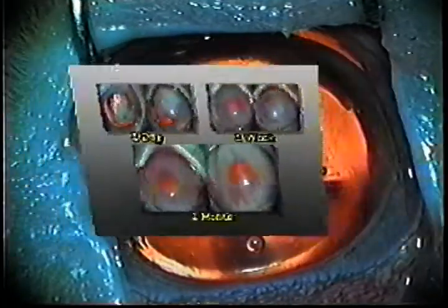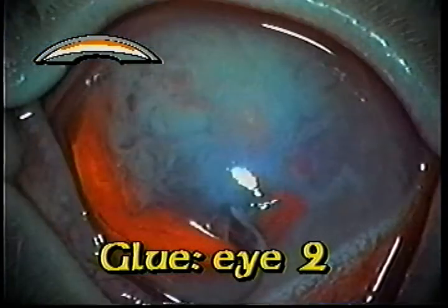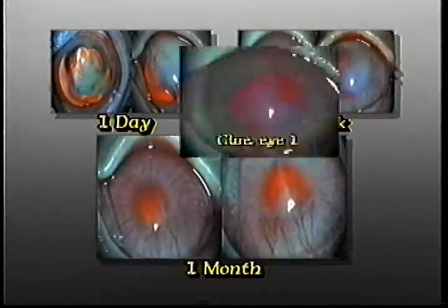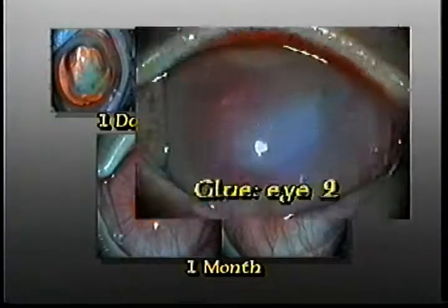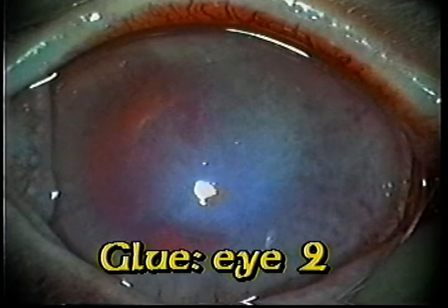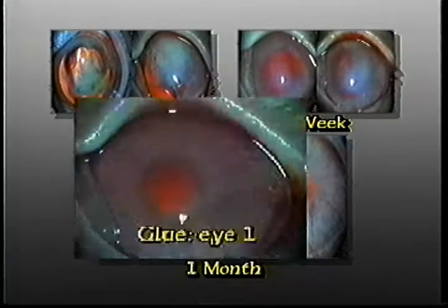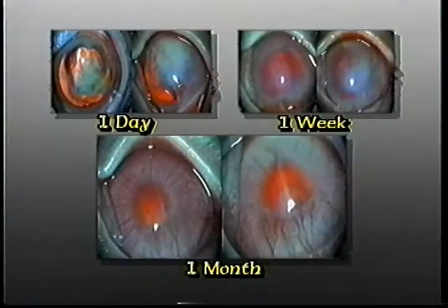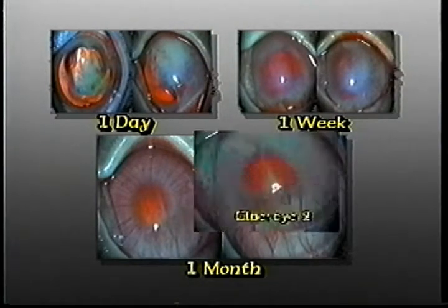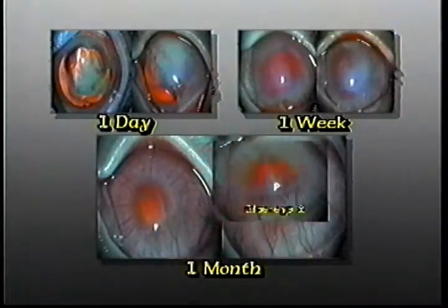In the first postoperative day, it was possible to see the glue stuck to the endothelium through the transparent cornea in both eyes. A week later, the glue in eye 1 had already been completely absorbed. In eye 2, there was still a certain amount of glue stuck to the endothelium. A month after, both corneas were totally clear and the Descemet's membrane perfectly reattached. The glue had been completely reabsorbed without a trace of inflammatory reaction.